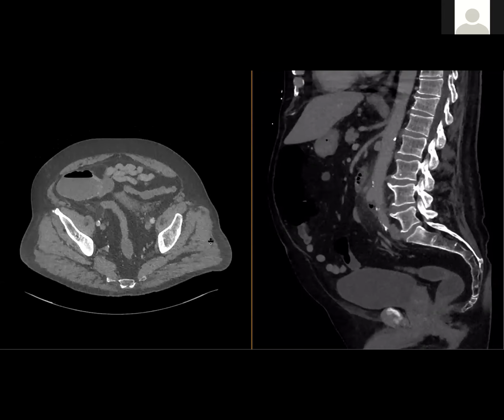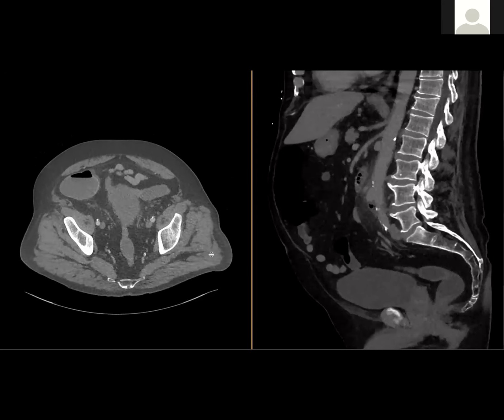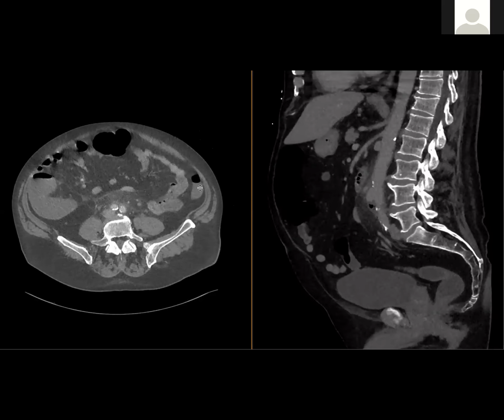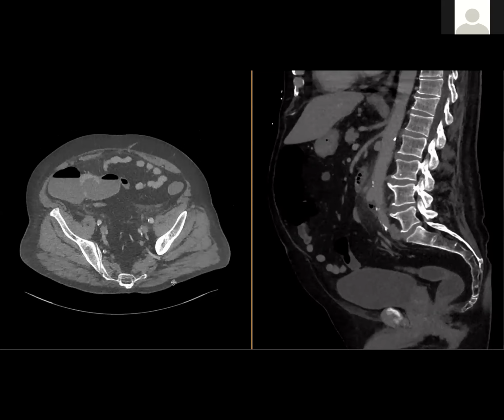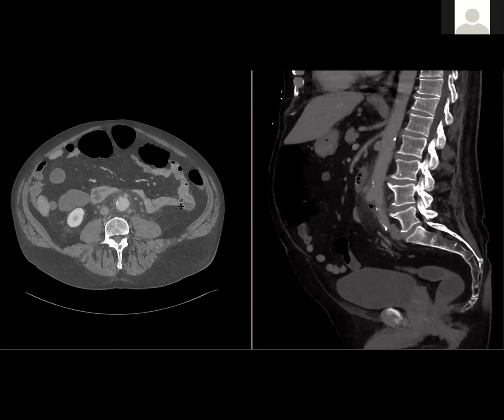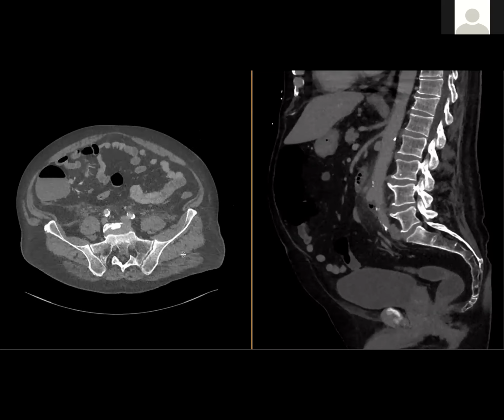Is there a mass in the right lower quadrant involving the TI? Yeah, cecum, TI, you're right. And actually they say if you see gas in a mycotic aneurysm, you should go look for a colon cancer because it can be associated. So this patient is septic. Is it Clostridium bovis? Close. There's two different bugs that are associated with this, and they each have one of those terms in it. One is Clostridium septicum, and the other one is Strep bovis. So this patient ended up having Clostridium septicum.